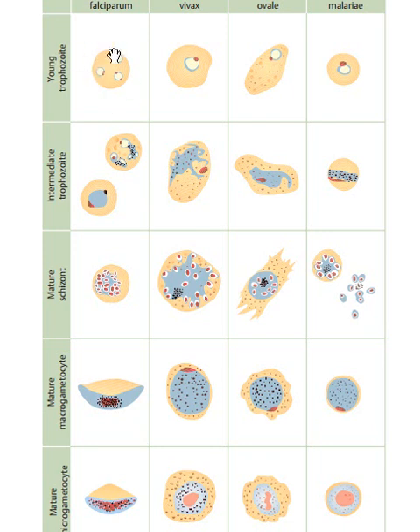So this is how a falciparum young trophozoite inside a red blood cell is involved. You usually have multiple trophozoites inside the red blood cell. Here you only have a single trophozoite inside the red blood cell. Here you also have a single trophozoite inside a red blood cell with other inclusions here. And then here you have a single one. So this is vivax, ovale, malariae.